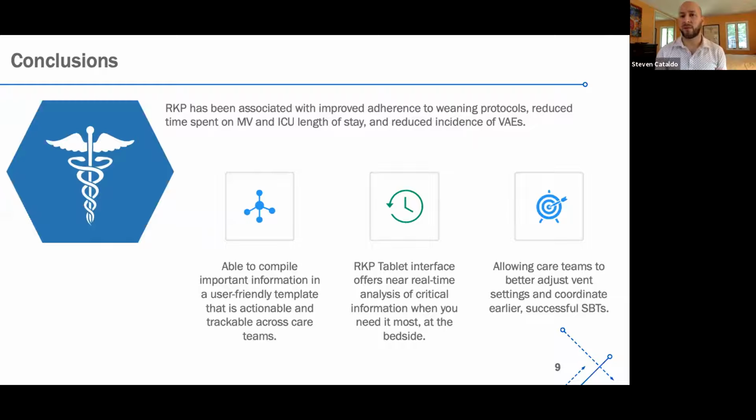It allows us to more actionably adhere to these protocols, because one, it's being tracked, of course, but two, it's available to everyone. So you get real-time feedback on yourself. How well am I doing?